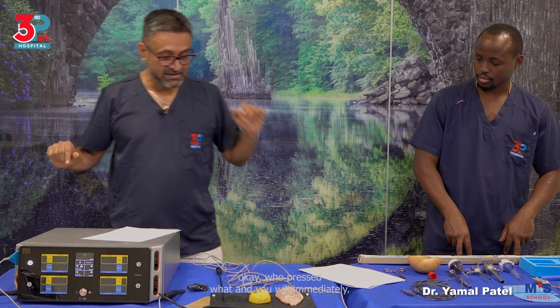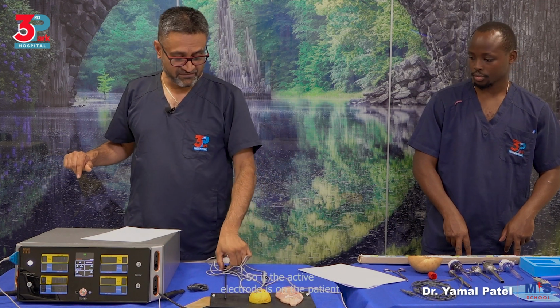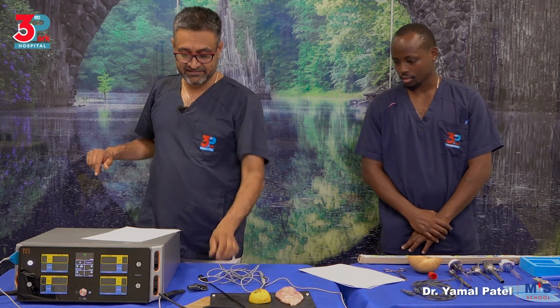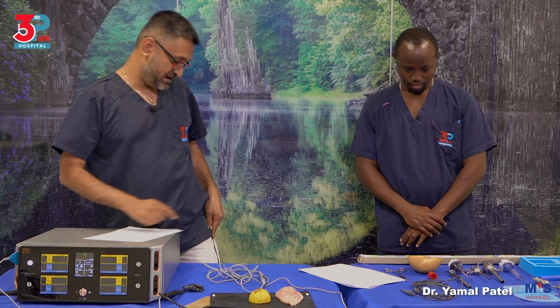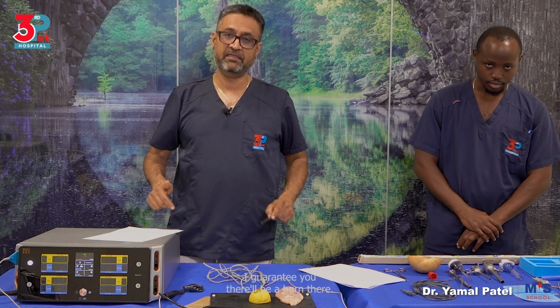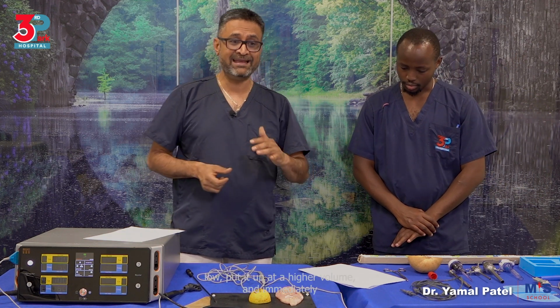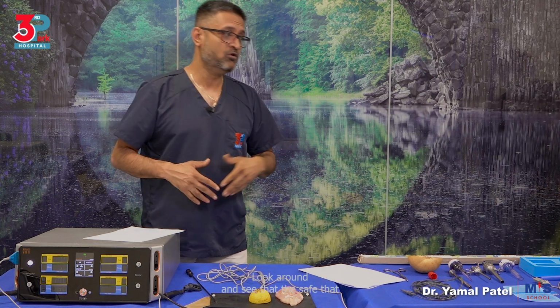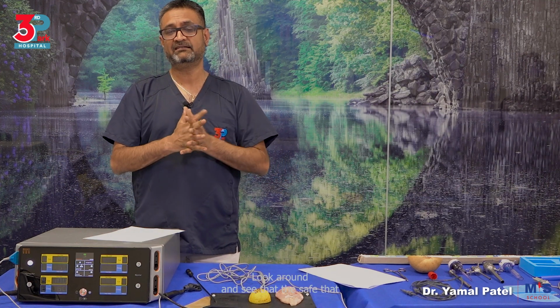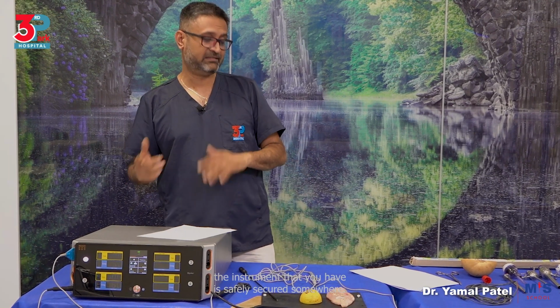And your job is to look for where the active electrode is. So if the active electrode is on the patient, just lying on the patient like this, and it was pressed by mistake, I guarantee you there'll be a burn there. So you try not to leave the volume low, put it up at a higher volume, and when there's an inadvertent pressing of the button, look around and see that the instrument that you have is safely secured somewhere.